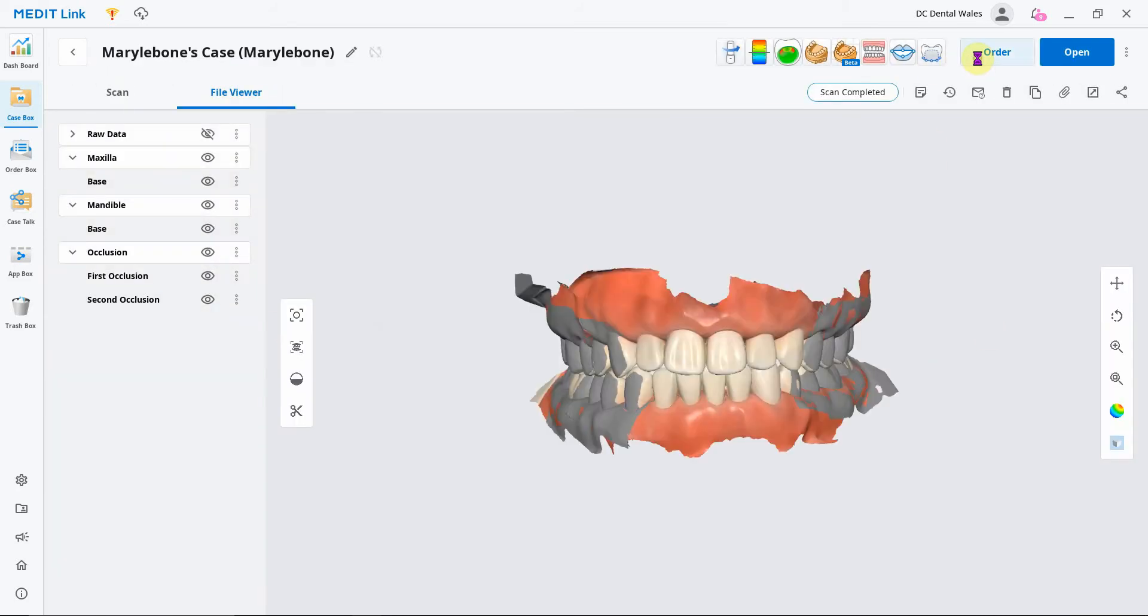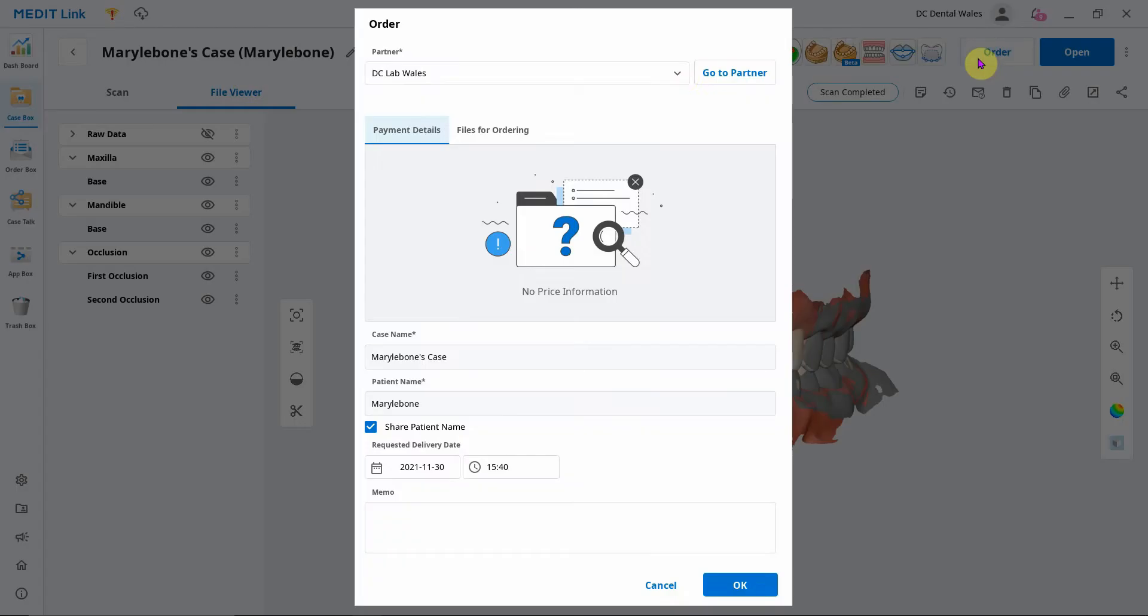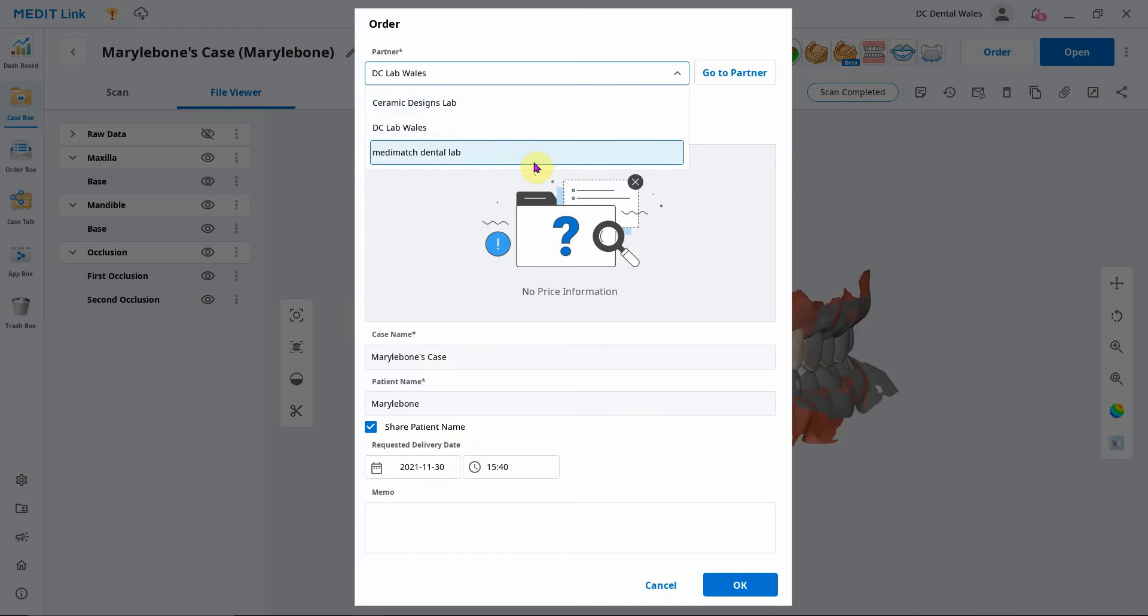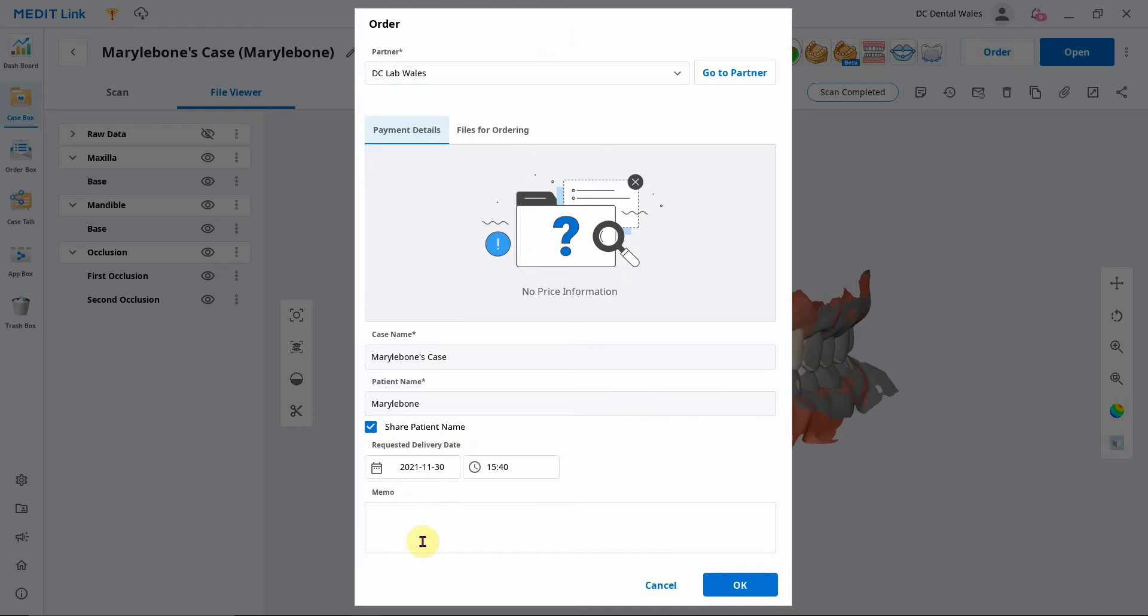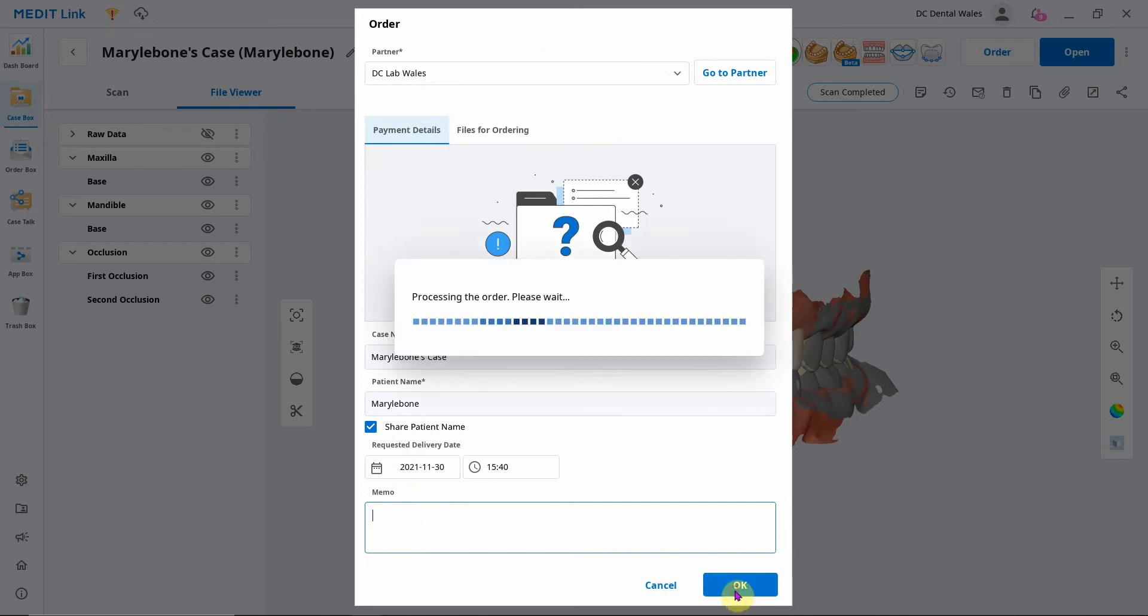You can click order, and then whichever lab you're paired with will be in this list here. You can select whichever one you want, put in any notes with the case, a requested delivery date, and then just click okay.